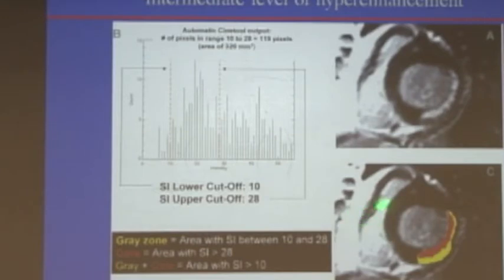I'll show you some slides later on where we refer to this as a heterogeneous zone. But in fact, yes? Did you quantitate the scar in the longitudinal dimension also, or just transverse? This analysis is typically done just in cross sections, and you could do it either way. I don't think there's any reason why one way would be better than the other. But classically, it's been done this way, because then we do stacks of them and build 3D reconstructions.